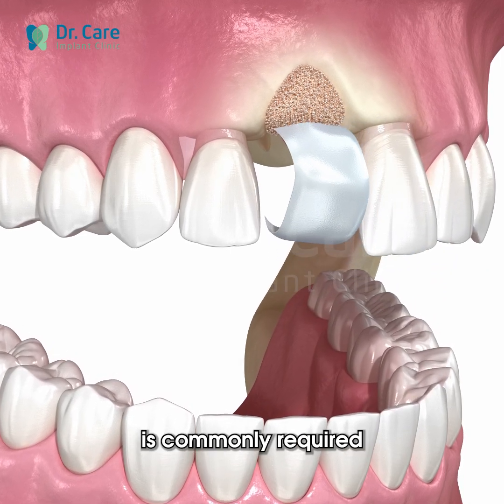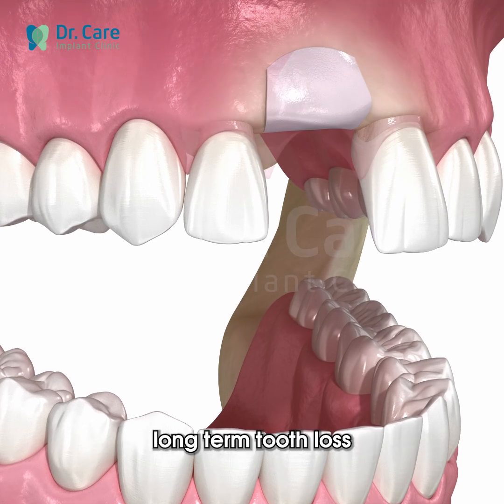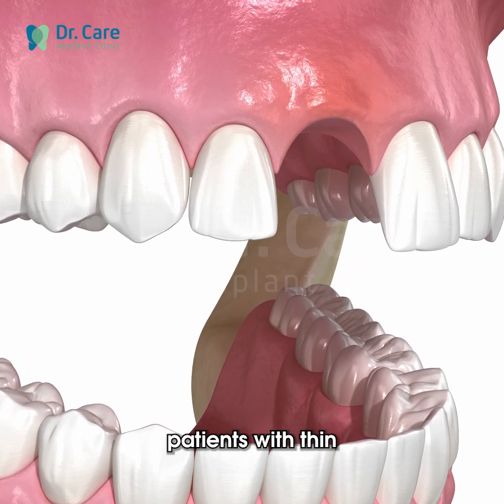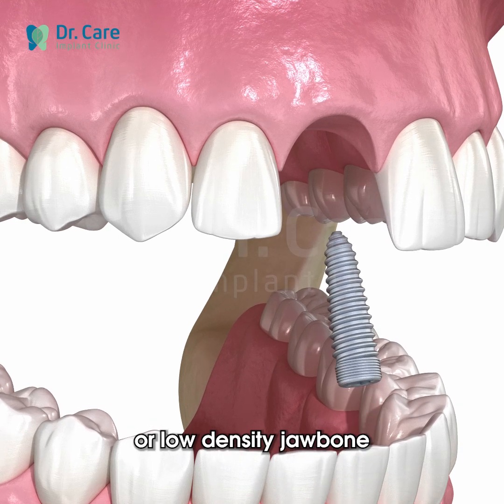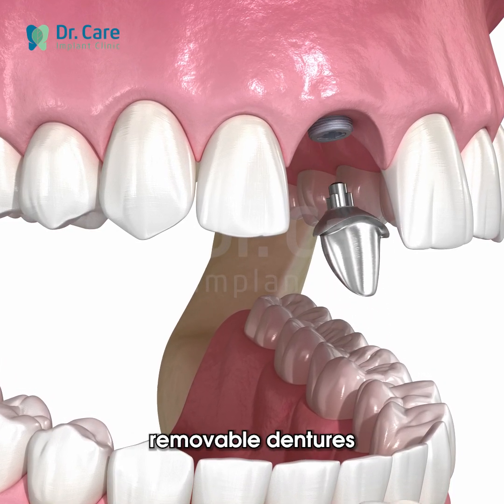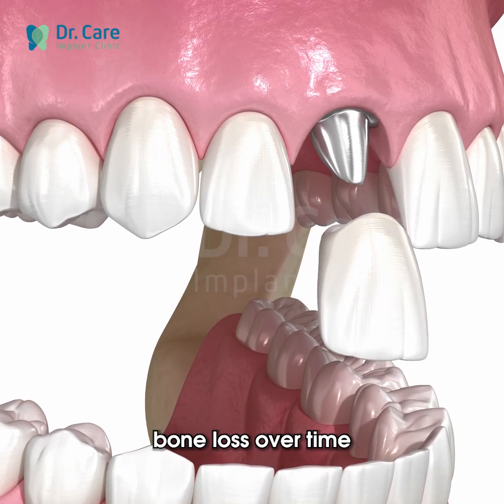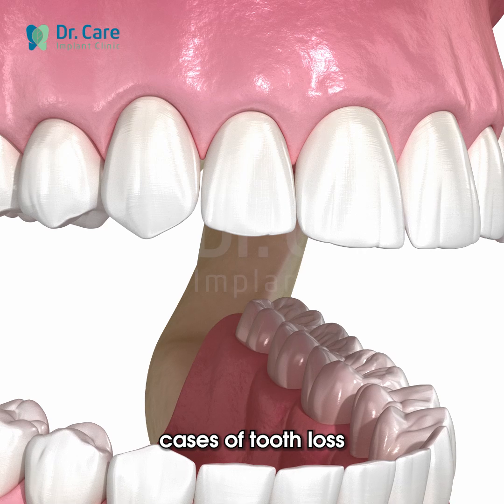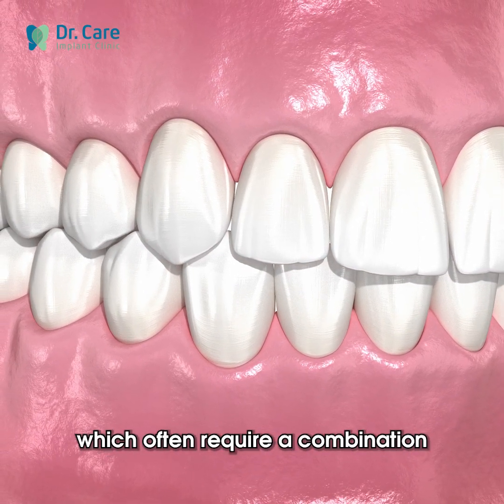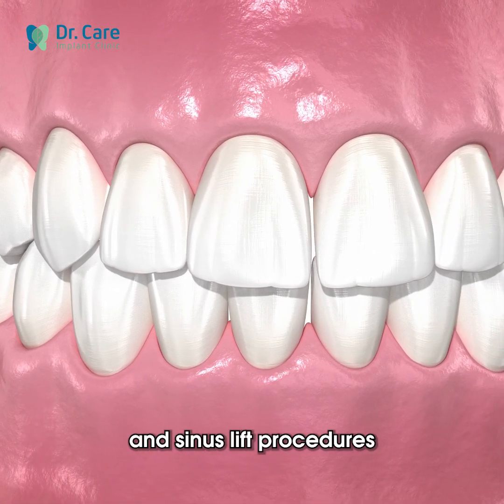Jawbone grafting is commonly required in the following cases: patients who have experienced long-term tooth loss leading to severe jawbone resorption, patients with thin or low-density jawbone insufficient for implant placement, patients who have worn removable dentures or dental bridges, resulting in progressive bone loss over time, cases of tooth loss in the posterior maxilla, upper jaw, near the sinus cavity, which often require a combination of bone grafting and sinus lift procedures.